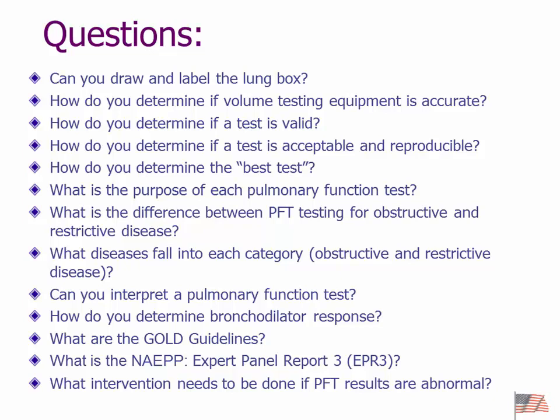So this is kind of a review for you. Can you draw the lung box? Can you fill in all the values? If not, we may need to get up to speed on that. How do we determine if volume testing is accurate? We're going to go ahead and use a 3-liter calibrated syringe, and we want it to be within 3.5% of that 3 liters.